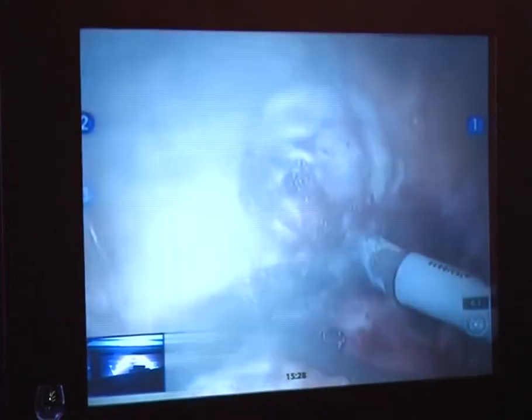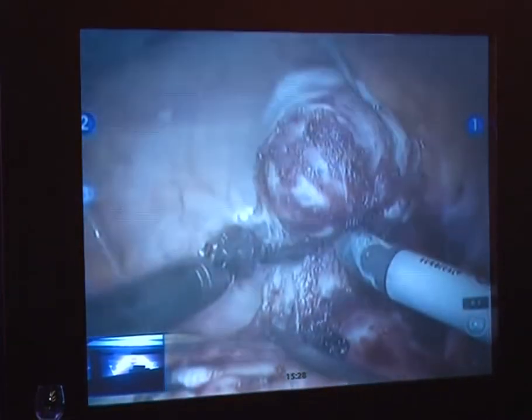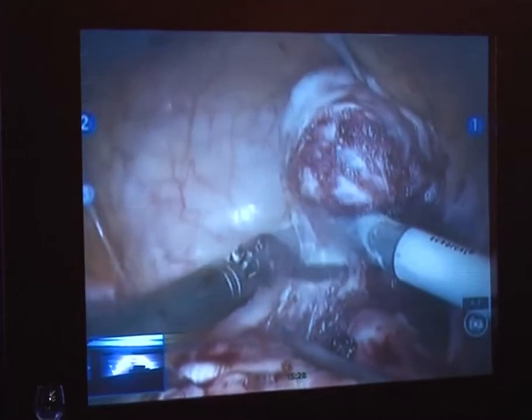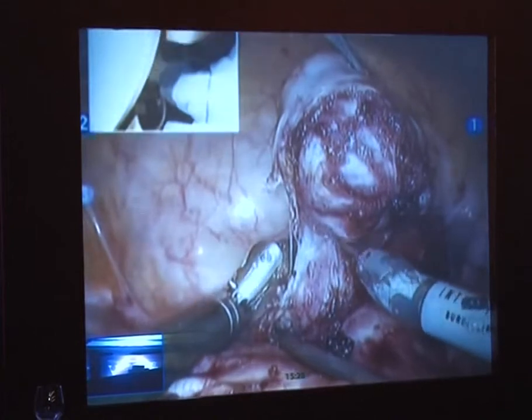But what I'm going to do now is, if I can get the needle driver for the scissor, I've got another piece of V-Loc in here. We're going to go ahead and close that defect up with a running barb. Any other questions? You guys change this out for me, please.